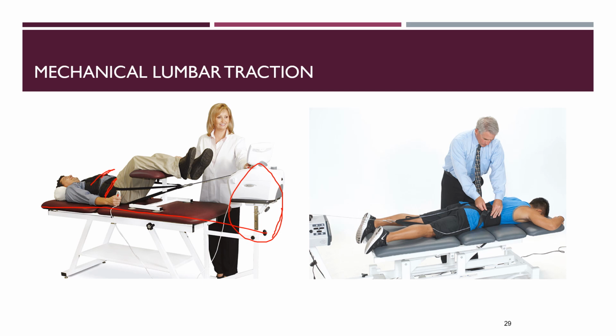If the legs were completely straight, then we're thinking that's lower lumbar spine. That's going to be your L5, L4, maybe S1 area. So you can definitely use this position in supine with the legs elevated. That's perfectly fine, but you would be targeting some of the upper lumbar spine.